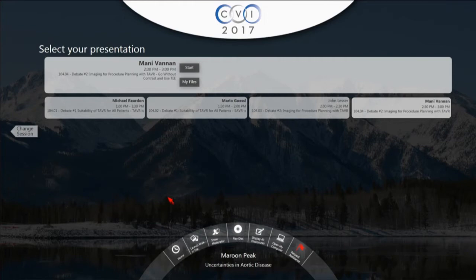It sounds like a CoreValve site. Yeah. It has been a routine. We use a lot more CoreValves than we do others, along with the fact that none of us accept any PVL anymore. So we post-dilate to make sure there's no more PVL. If there's anything at all, we're going to post-dilate before we leave.